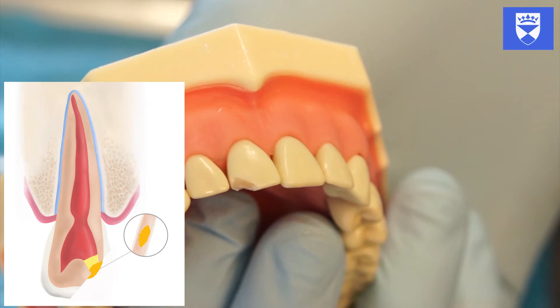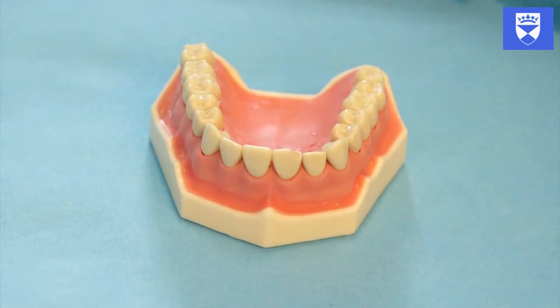In this video we can see that the previous pulpotomy undertaken has been covered with glass ionomer. It is now time to place a restoration that covers the exposed dentine and enamel.